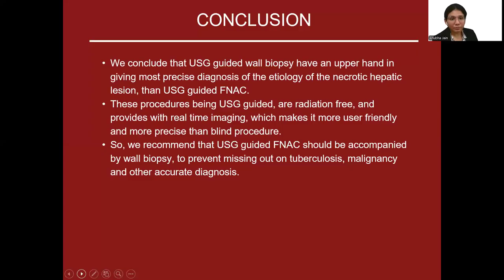Concluding my study, we conclude that ultrasound-guided wall biopsy has an upper hand in giving the most precise diagnosis of the etiology of the necrotic hepatic lesions than FNAC. These procedures being ultrasound-guided are radiation-free and provide real-time imaging, which makes them more user-friendly and more precise than blind procedures. We recommend ultrasound-guided FNAC should always be accompanied by wall biopsy to prevent missing out on tuberculosis, malignancy, and other accurate diagnosis.